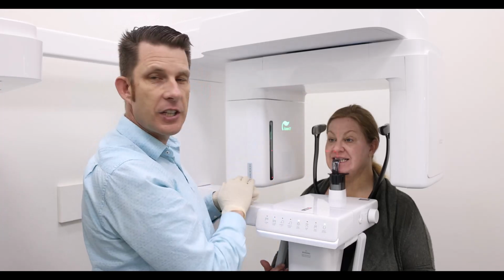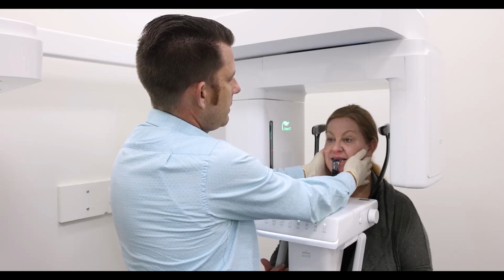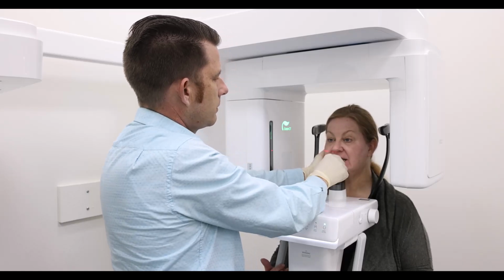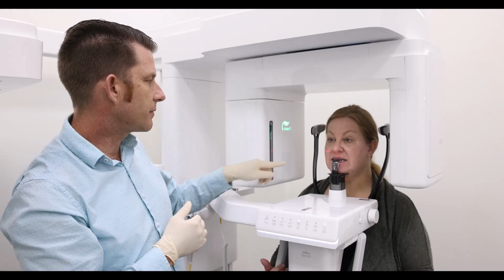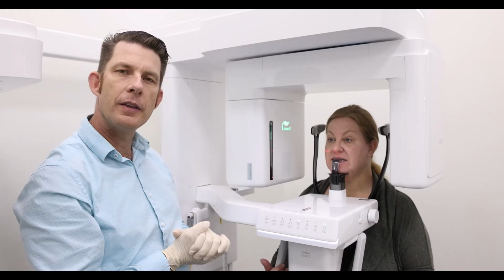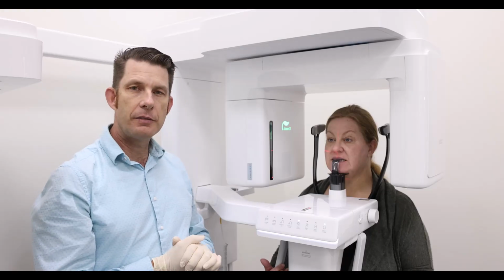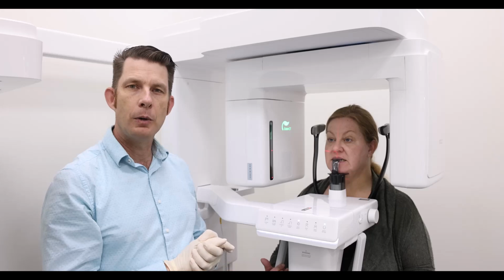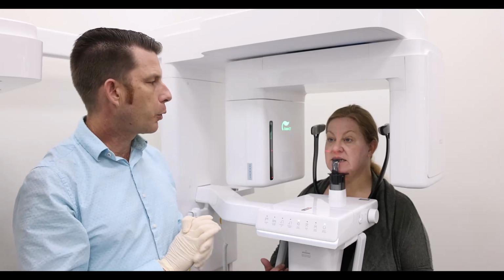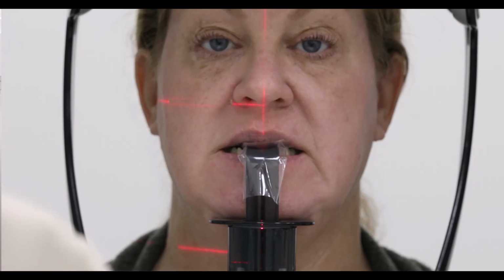Next, I'm going to make sure the patient is lined up center. We're going to go ahead and get you lined up center here. Perfect. Chin's on the chin rest. Couple things to note. We have a horizontal beam shining on the right side of the patient's face. Depending on the field of view you've chosen, it depends where that horizontal beam will be located. The important thing to remember is that the horizontal beam is the center of the height.